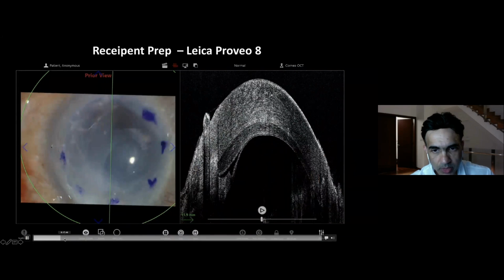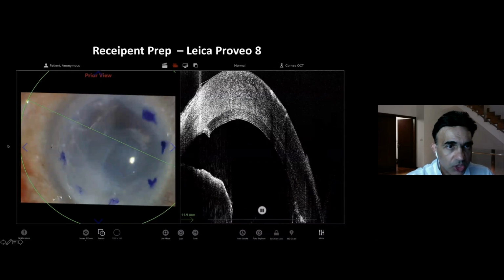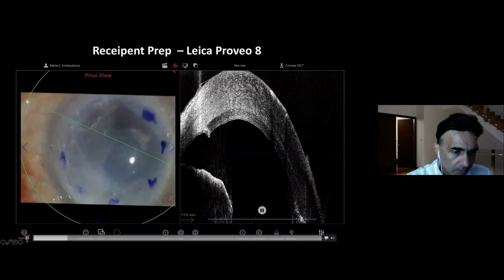I'm using the 360-degree mode to help. No, I think this video is not going to help me, so I'll just come out of this. I'll just show you the insertion bit for this case instead, because I don't think it's going to work.